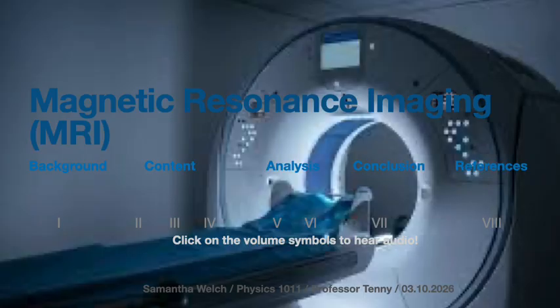That Larmor frequency equation shows that the frequency at which hydrogen nuclei rotate depends directly on the strength of the magnetic field. MRI machines are designed to send radio frequency pulses at exactly that frequency so the hydrogen nuclei absorb energy efficiently. That process is what is known as resonance.